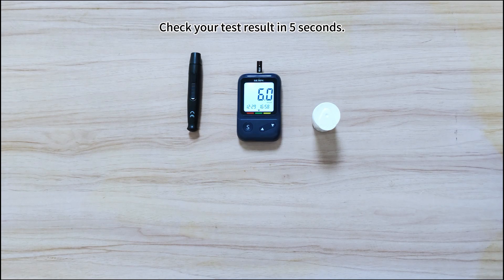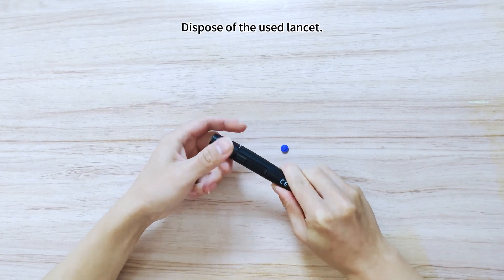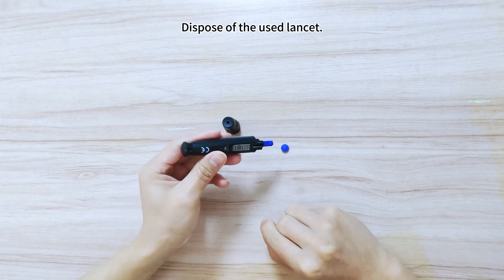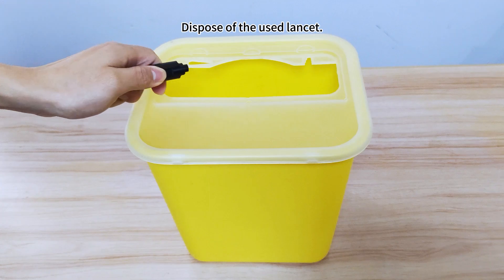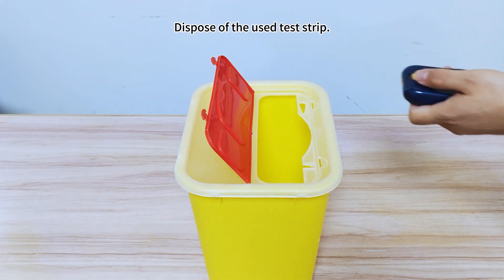Tests will be automatically stored in your meter. Safely dispose of the used lancet. Use the test strip ejector switch to quickly dispose of the test strip.